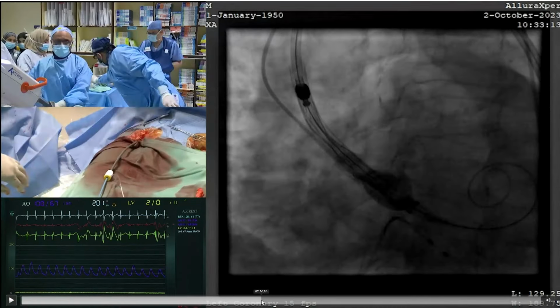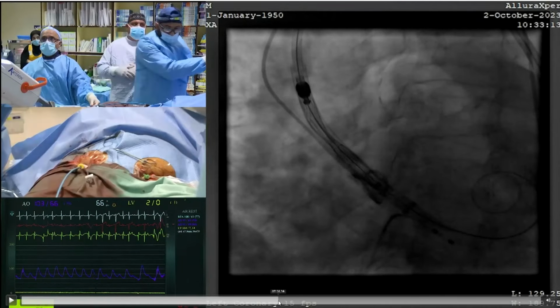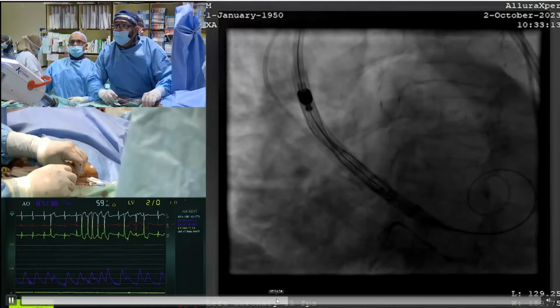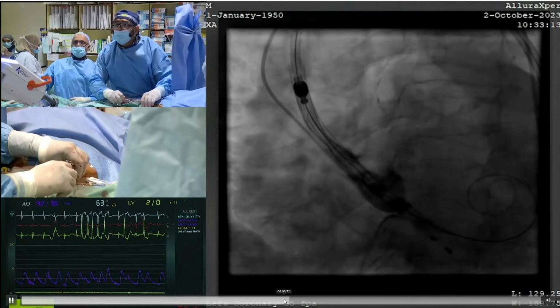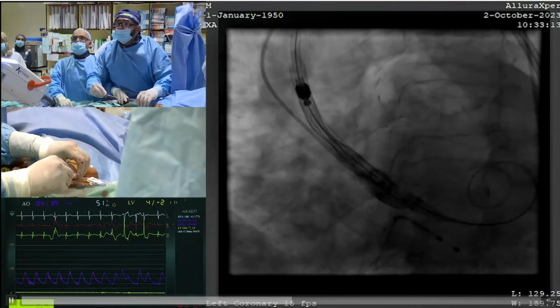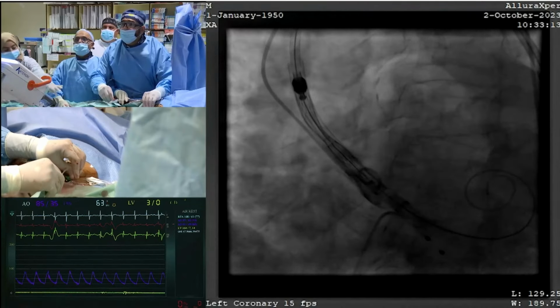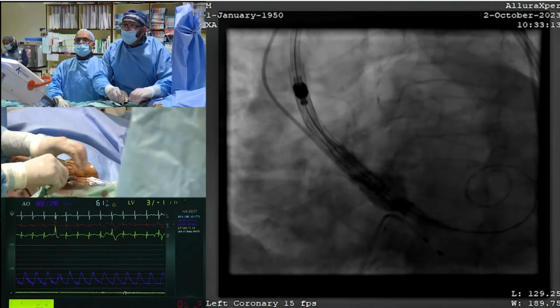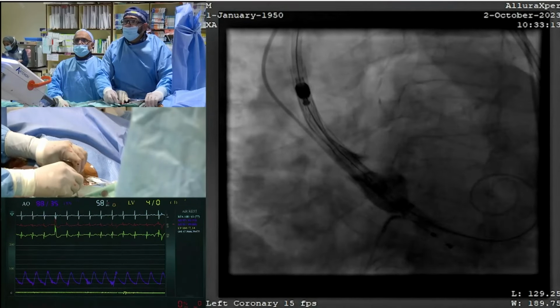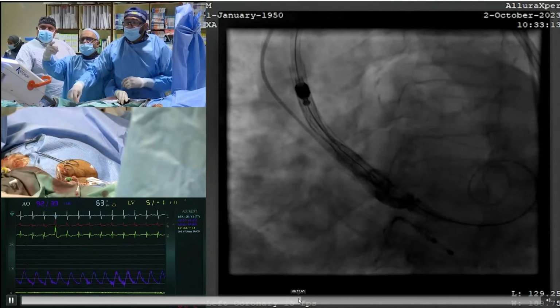It's okay. For those who don't know the valve, this is also a sheathless system. You have a 14 French for the 23-25, 15 French for the 27-29. It's an intra-annular valve, long frame, and with a very flexible system, the FlexNav. And for the question of the pacing, the valve starts functioning very quickly. So you don't get a drop of blood pressure like the others. It's very stable, the pressure will be there while you are deploying even. So you can take your time while deploying the device.